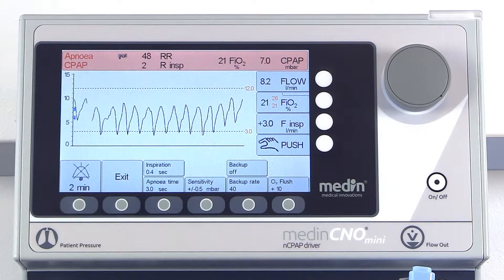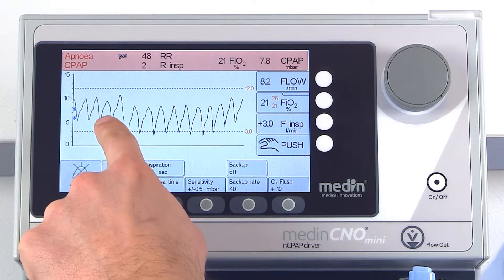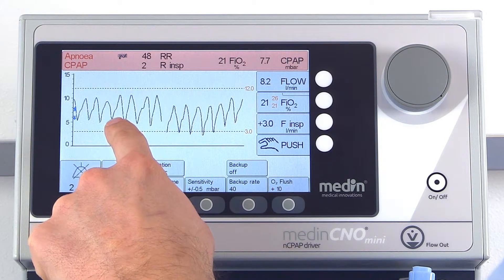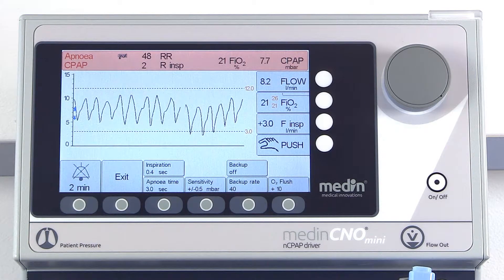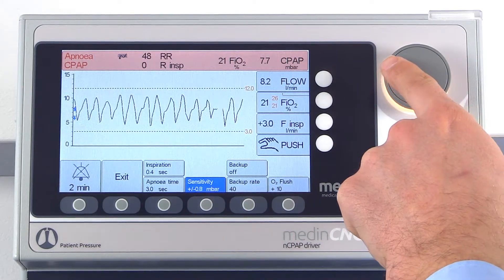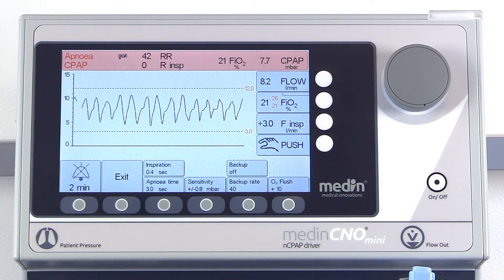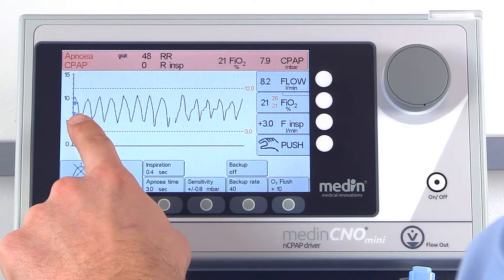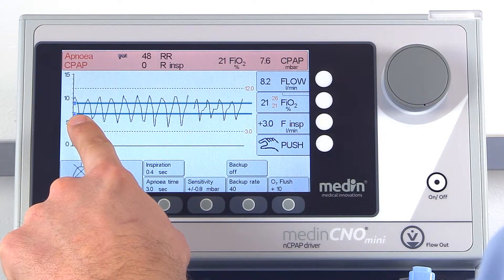The baby's inspiration and expiration generate the upper and lower pressure levels. The sensitivity of the pressure trigger can be adjusted manually, enabling you to react properly to the baby's spontaneous breathing activity. The pressure trigger is set correctly when the pressure fluctuations during spontaneous breathing go beyond the trigger thresholds, which are indicated by blue arrows.